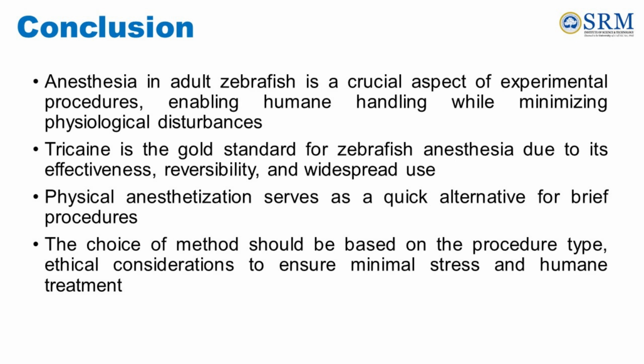The choice of method should be based on the procedure type, ethical considerations to ensure minimal stress and humane treatment of the experimental zebrafish.